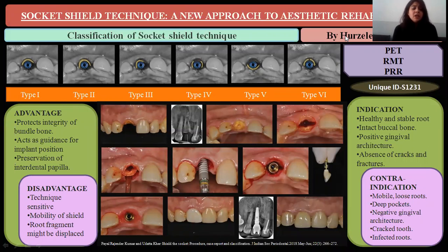We are presenting a poster named Socket Shield Technique, a new approach to aesthetic rehabilitation. The socket shield technique was given by Hürzeler in 2010. This technique is also known as the partial extraction therapy, the root membrane technique, and the partial root retention.